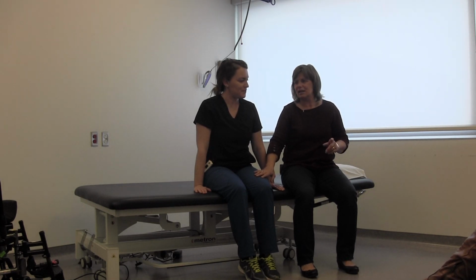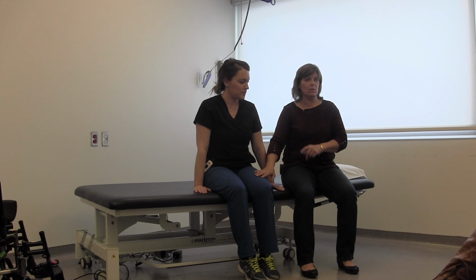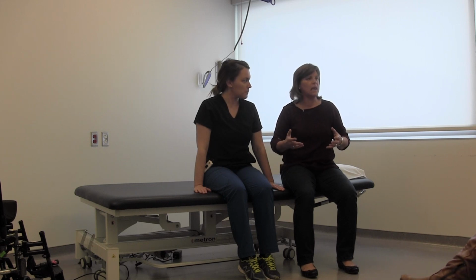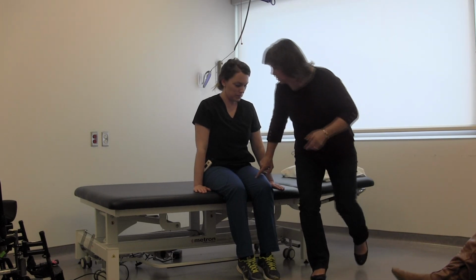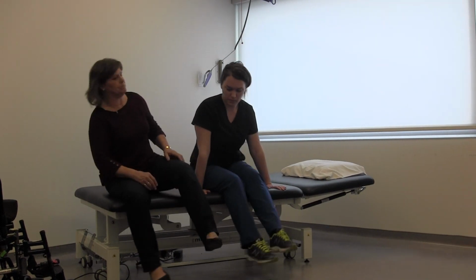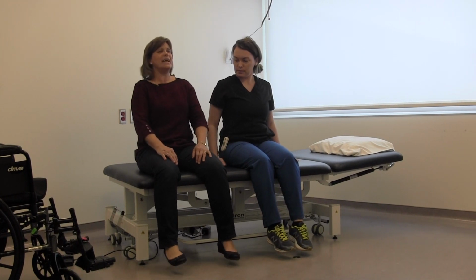So one of the key things in getting someone ready or transferring somebody is actually preparing their position for the transfer, okay? So we're going to do just a really basic movement lab in order to demonstrate this, okay? So I want you to sit right back on the bed. You guys sit right back in your chairs, okay? And we're just going to slouch. It's like late in the afternoon.